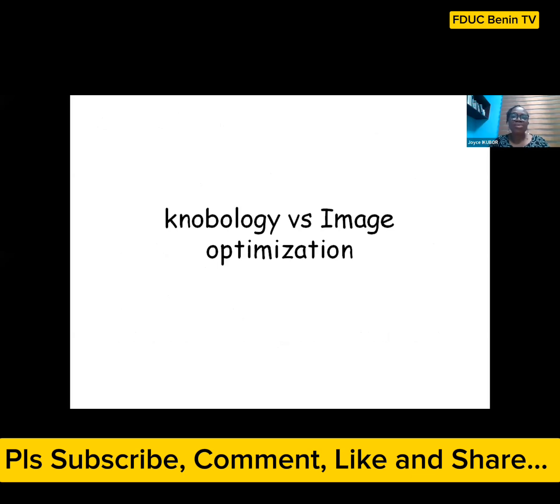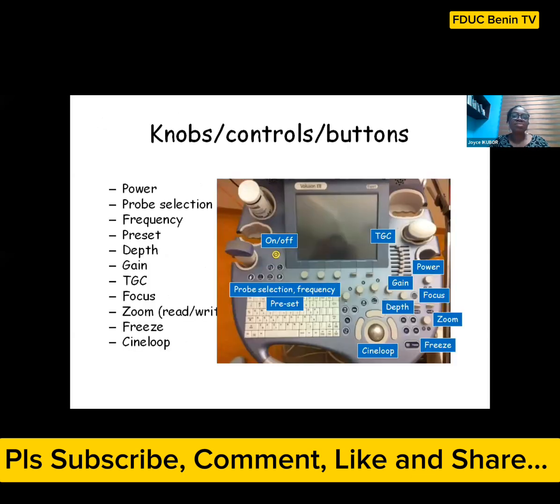So again, I will keep stressing it that the whole aim of Knobology is image optimization. We want to ensure that we get proper images, optimal images. I'm sure we're all familiar with this picture. This is how most ultrasound machines are when you see them. So this is how you see the knobs or the controls or the buttons.